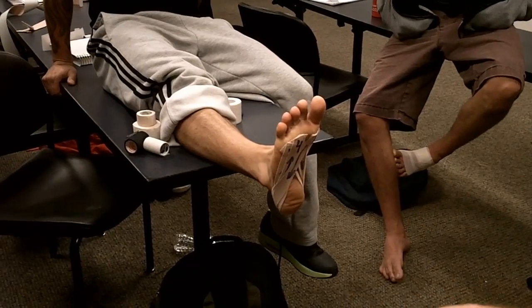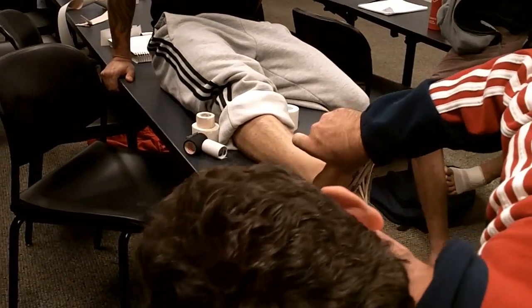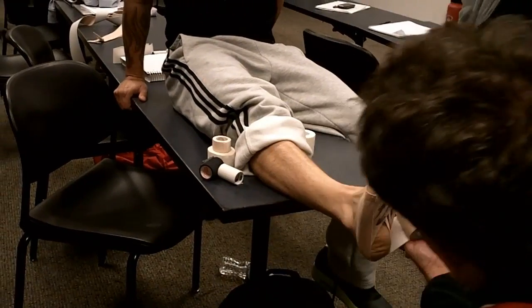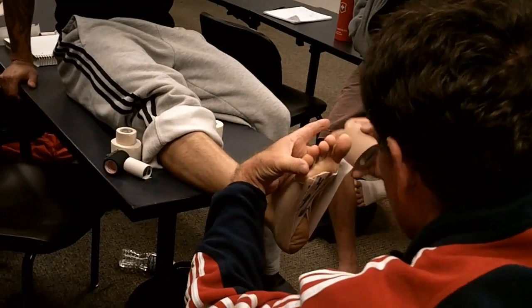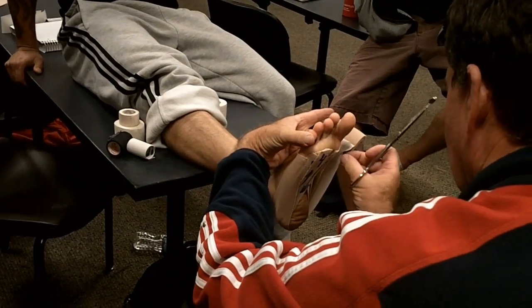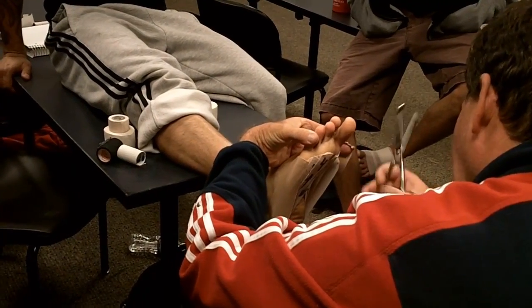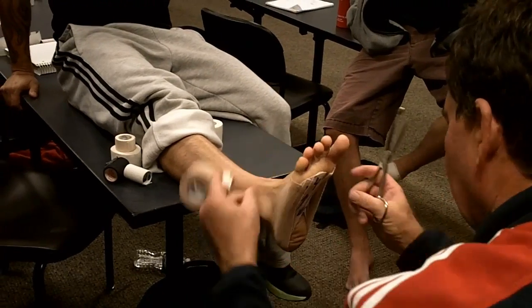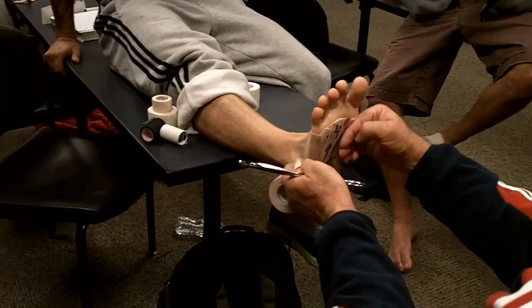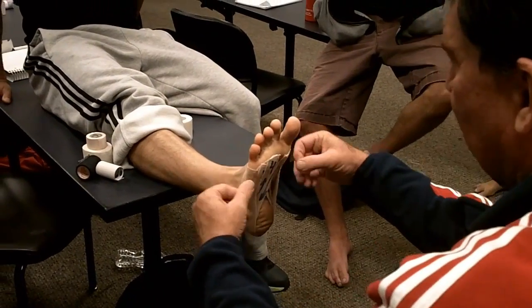For someone weighing more than 130 pounds, I'd probably come — because I'm trying to pull this down — I'll come here, pin it, come around, and go five to one. And this is going to assist in the elasticity and the absorption of impact when the foot splays. This piece around here is going to further support that. For somebody really light, I might not do the five to one at all.